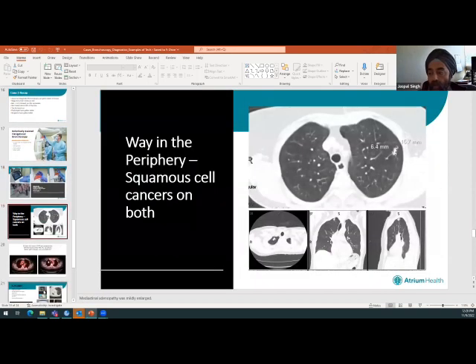And so now we're actually at the point where way in the periphery of the lung, and it may not be obvious, this patient has severe emphysema. So not only do some of the patients we have just lung cancer or suspicious for lung cancer, but we're also biopsying people that are older, that have lung disease, maybe heart disease, maybe some issues that they need to be on blood thinners, so that things become higher risk. But we're being asked to do more complicated things. So having that precision is really helpful because we're trying to avoid complications while getting answers.